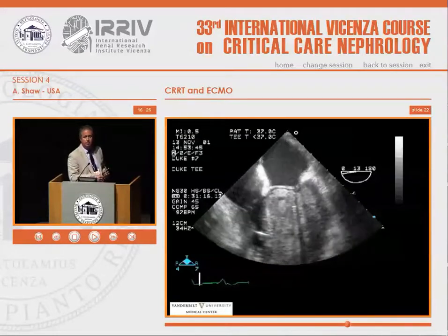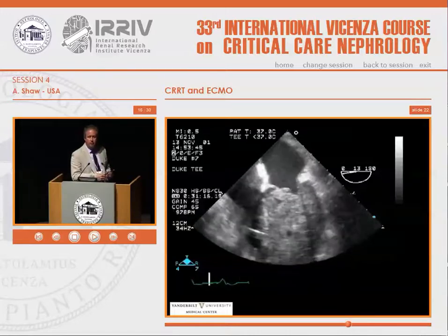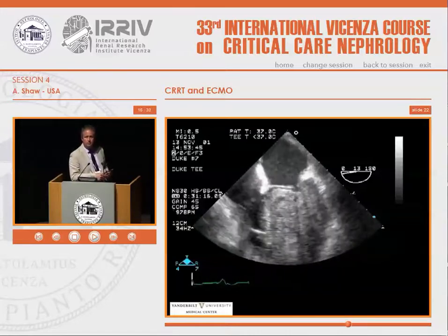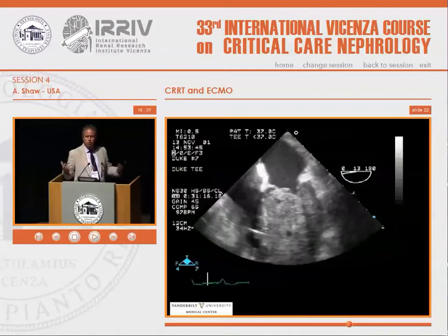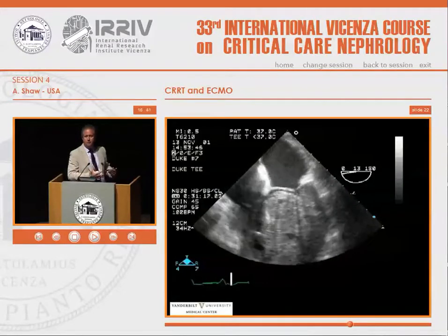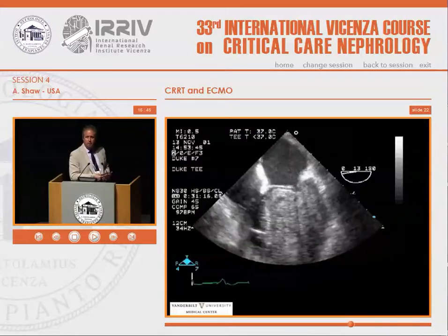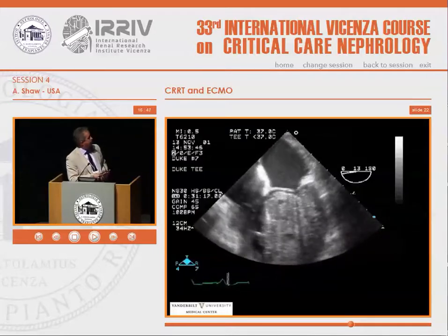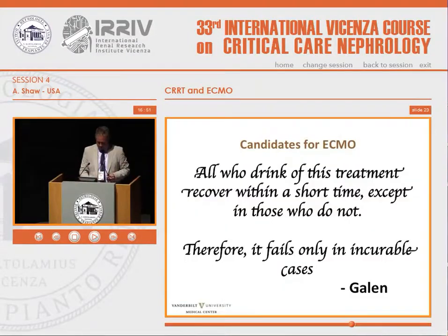The reason this happened is because the patient was bleeding, and someone thought it would be a good idea to give recombinant factor 7. And when you do that in a patient with a huge extracorporeal surface area, if you will, it generates widespread extrinsic coagulation and essentially clotted first the patient's heart, then the pipes, and then the pump. So don't do that.